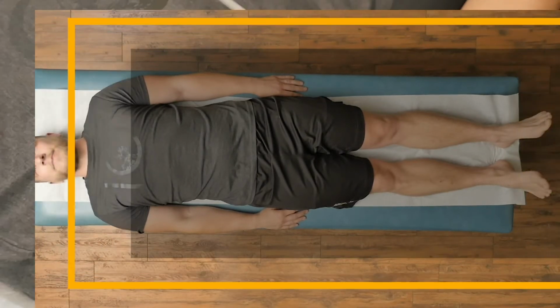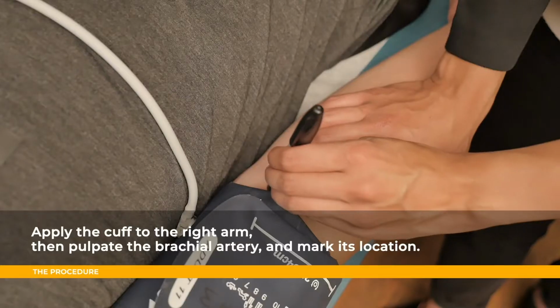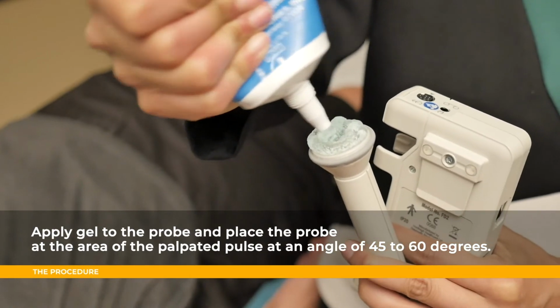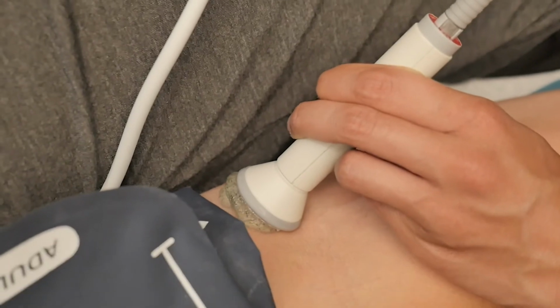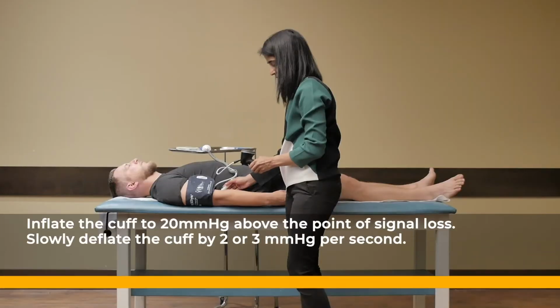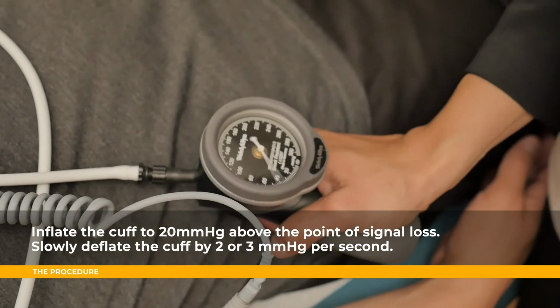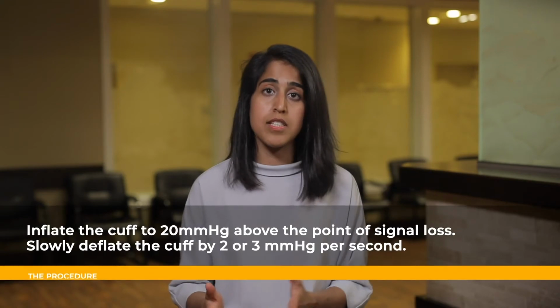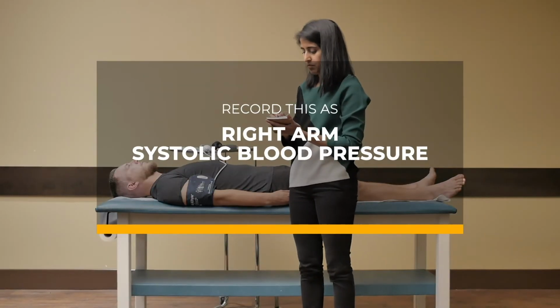So start by applying the cuff to the right arm, then palpate the brachial artery and mark its location. Apply gel to the probe and place the probe at the area of the palpated pulse at an angle of 45 to 60 degrees directed towards the head. Inflate the cuff to 20 millimeters of mercury above the point of signal loss. Then slowly deflate the cuff at a rate of about 2 to 3 millimeters of mercury per second until the signal returns. Record this as the right arm systolic blood pressure.